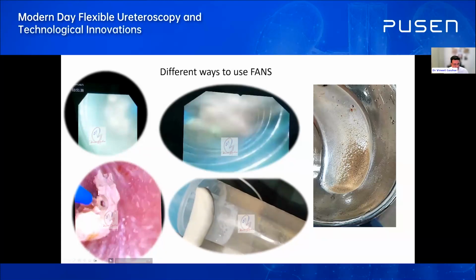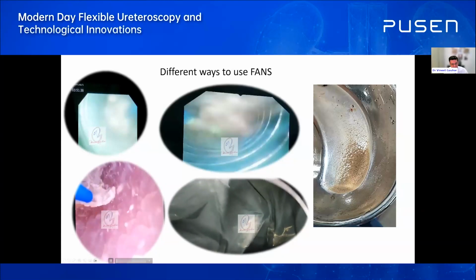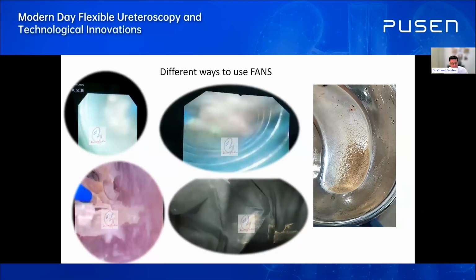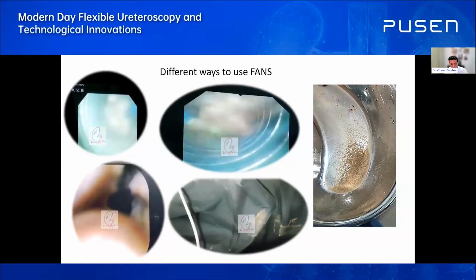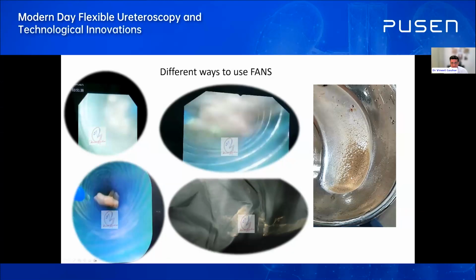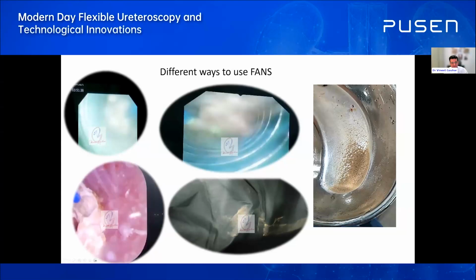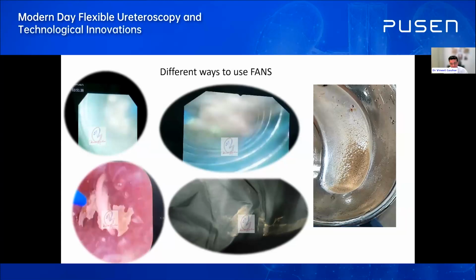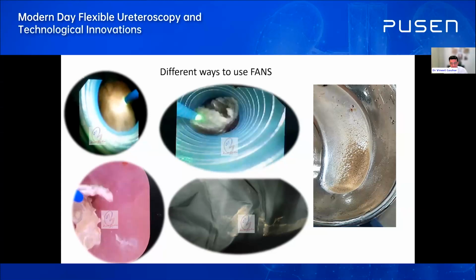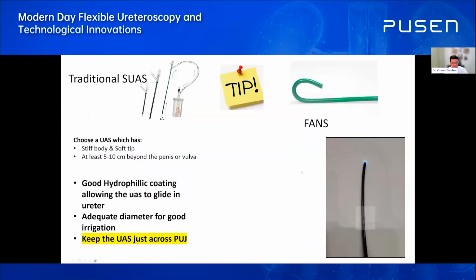And finally, last but not least here, once you have fragments and you really don't want to spend too much time, get all the fragments out. We have got up to 20 fragments at one time through a sheath when you apply the right amount of suction. This was a single kidney patient done under just some sedation, not even fancy anesthesia. We're able to get the entire stone. I'm really happy because I'm able to show my patient a single stage stone-free rate the next day, because we are so confident with this on table that we are able to do a CT scan the next day and show the patient, look, there's nothing left inside.